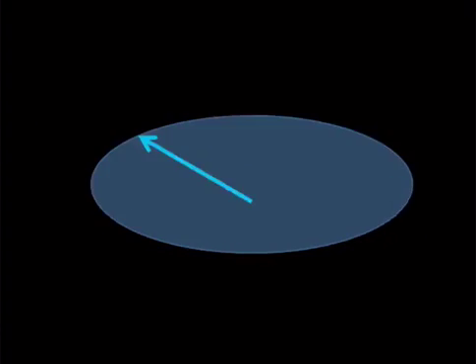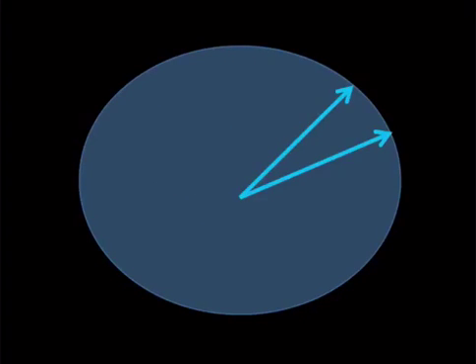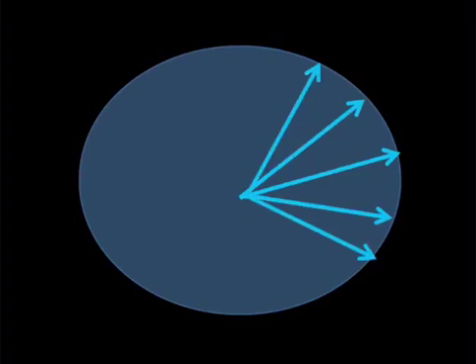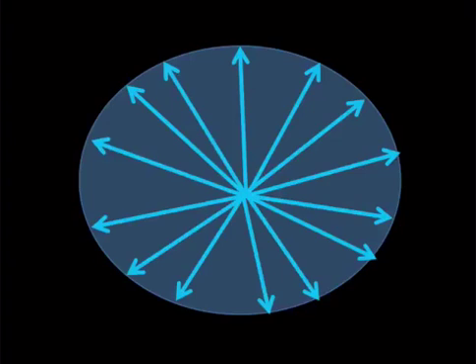Now, we've been lined up here. Let's turn this thing up so we can see it a little better. We're lined up here and we're precessing in phase. And then over time, we're going to lose energy so that we're becoming less and less in phase, and now we're totally out of phase. This is the natural state of things here. And this is referred to as decay, that is occurring in the transverse plane.